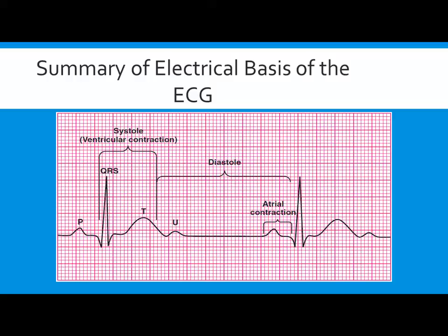So my P wave, I'm going to be looking at my PRI, I'm going to be looking at my QRS. Next thing I'm going to be looking at is ST elevation or depression. We're going to look at the QRS, back to the T, we're looking at the J point, and that's going to be the point where we might see elevation or depression. That point is actually supposed to be right on the isoelectric line, okay? Then T wave, what I'm looking for is really just the shape. Is it upward and rounded? Because I may have a tall spike T wave, and that may indicate an electrolyte imbalance.